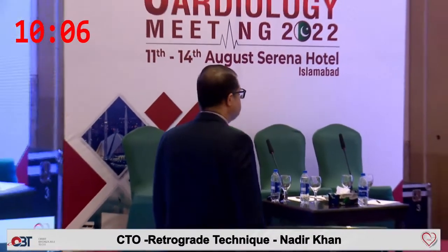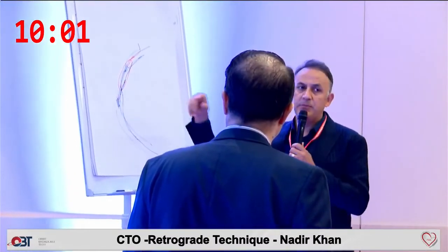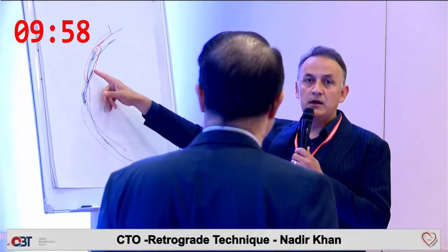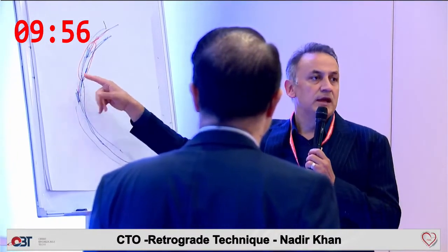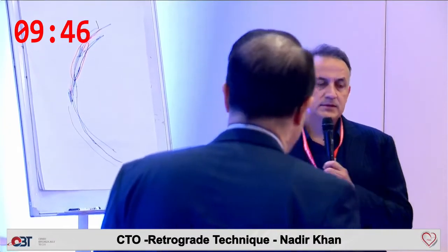In that case, we try to use a bigger balloon to have dissection at the true lumen. If you use a bigger balloon, you might have dissection. So then there will be a connection between true lumen and the subintimal space. So you create a dissection with the antegrade ballooning, and then take the antegrade wire into the subintimal space. So then both the wires are in the subintimal space, and then they can connect.